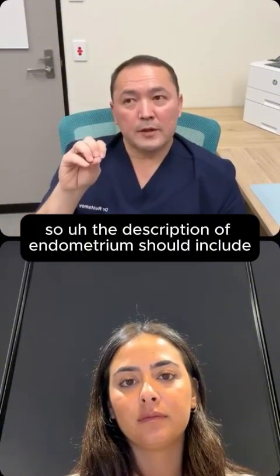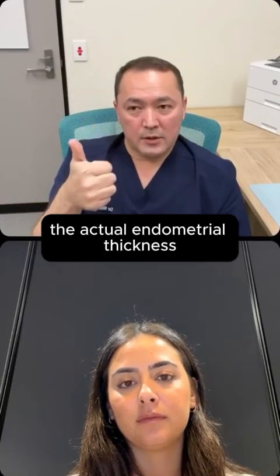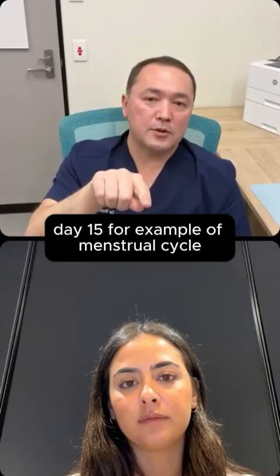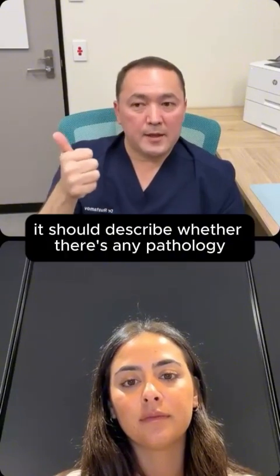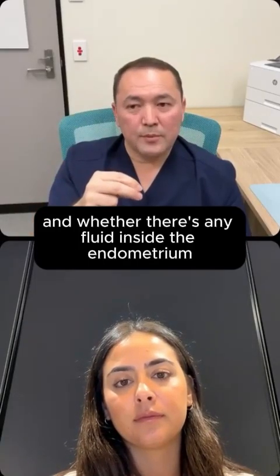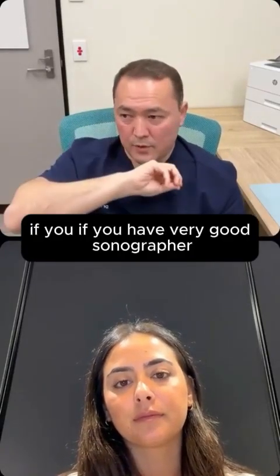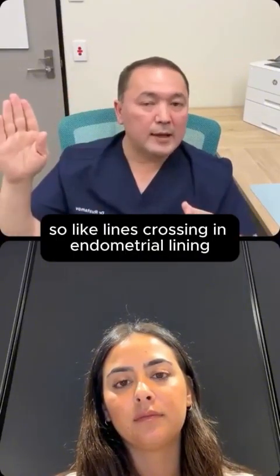So the description of endometrium should include the actual endometrial thickness. Then they should write, for example, today, day 15 of the menstrual cycle, endometrium measures, let us say, 8 millimeters. Second, it should describe whether there's any pathology like endometrial polyp, fibroid, and whether there's any fluid inside the endometrium, and whether any scar tissue. If you have a very good sonographer, they can see scar tissue, which is Asherman syndrome, like lines crossing the endometrial lining.